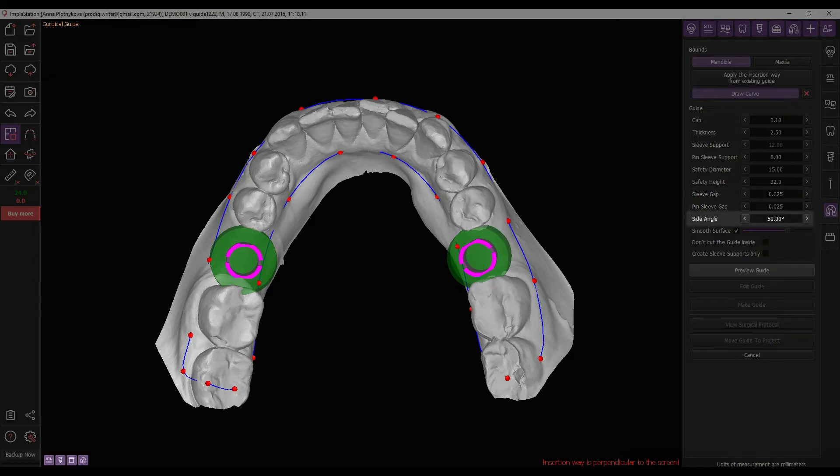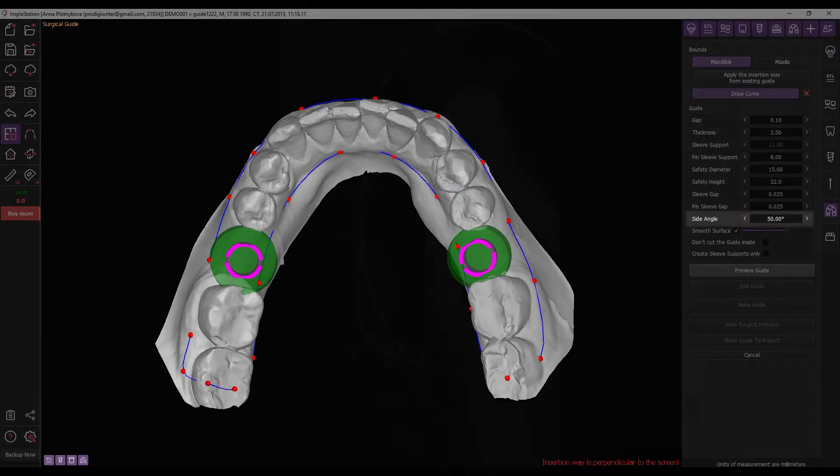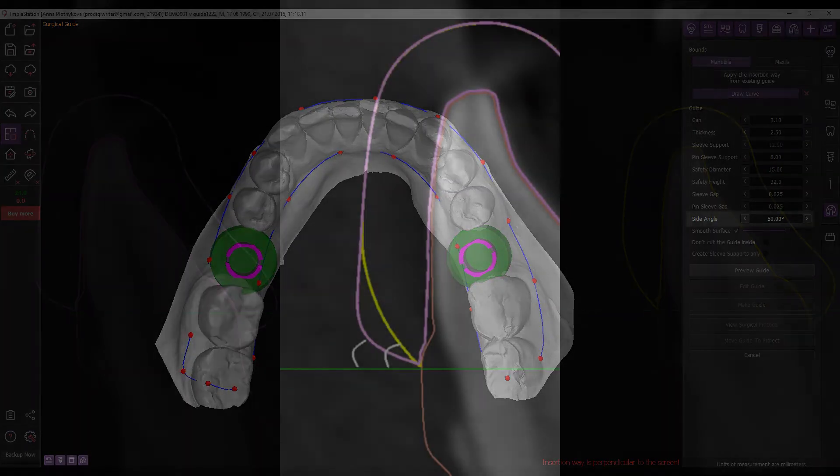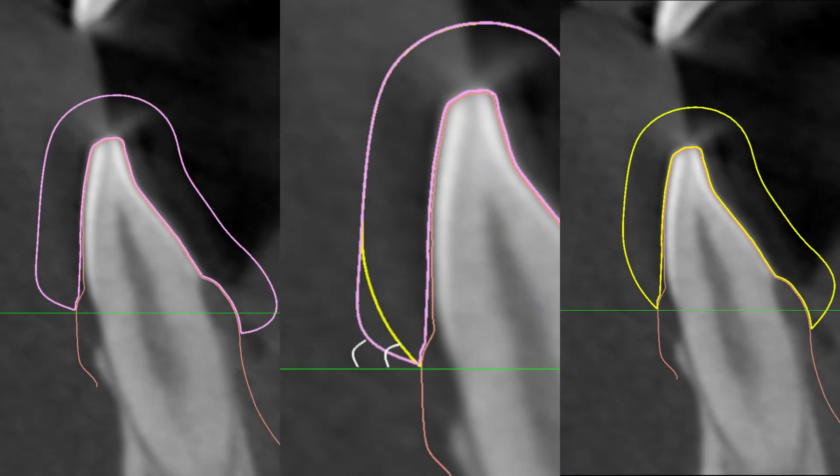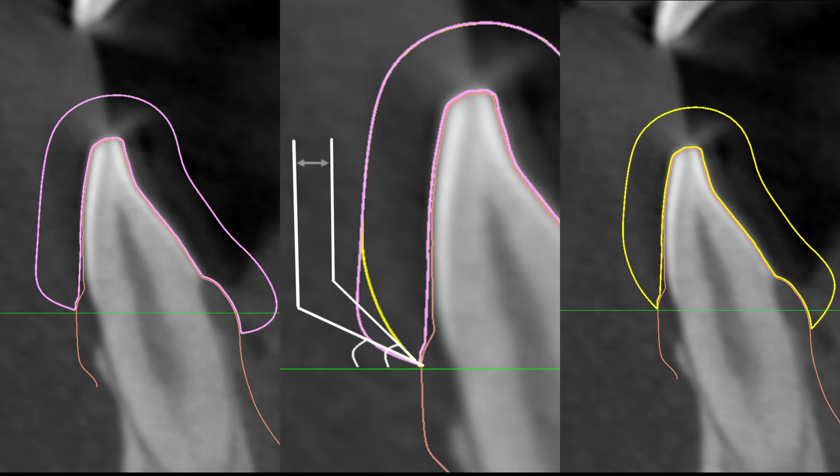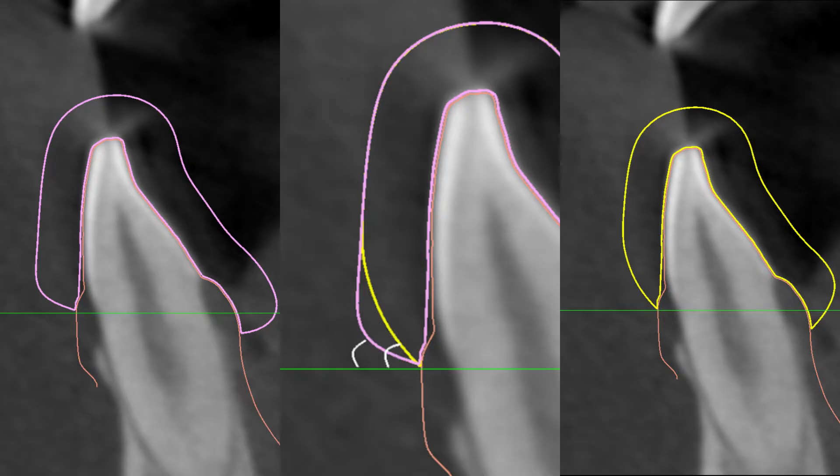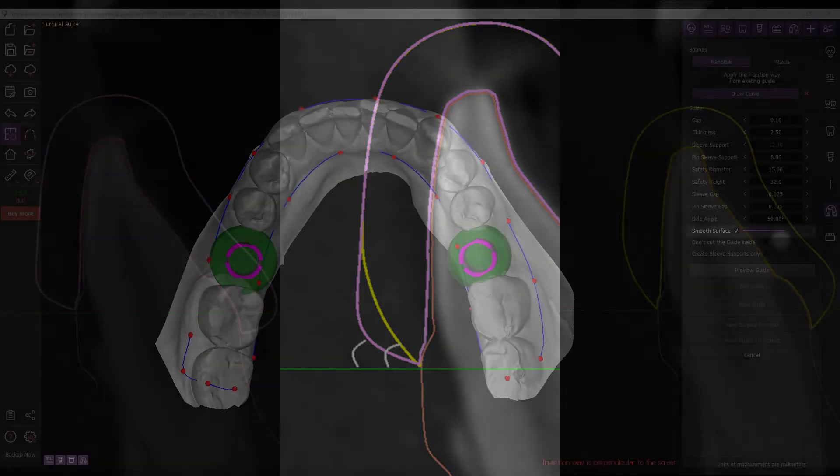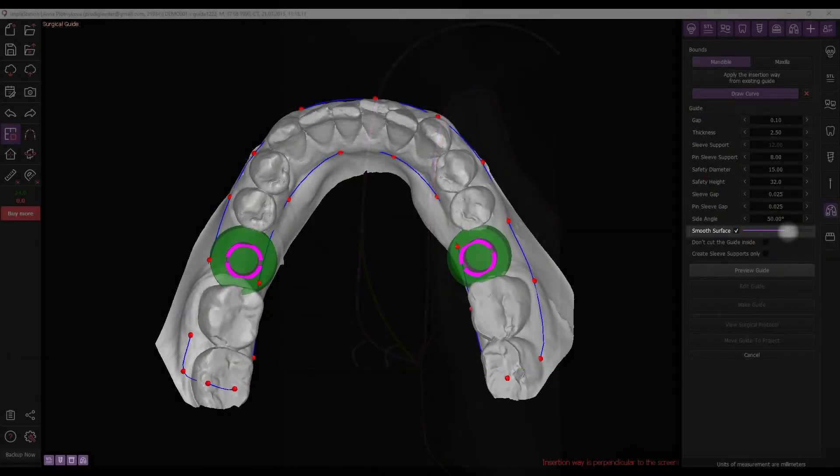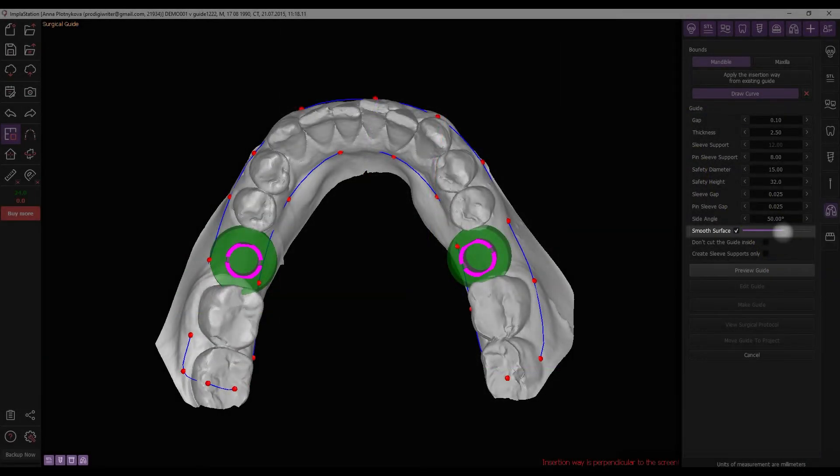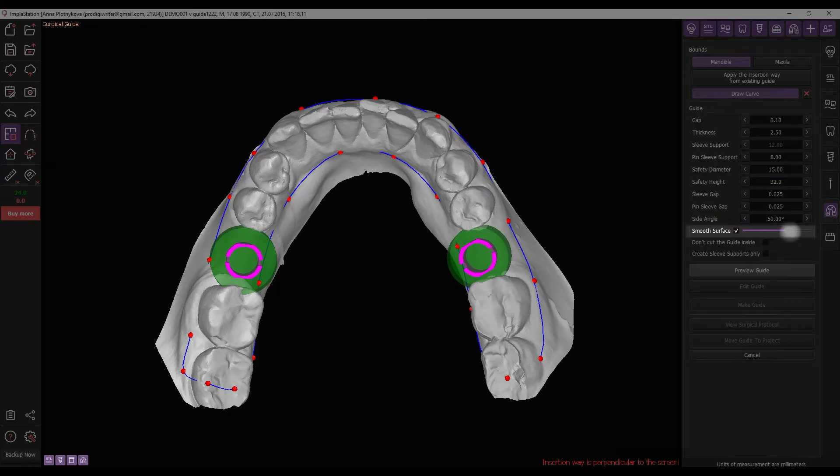Set the side angle. This parameter in guide generation determines the angle at which the vertical wall is cut, crucial for adapting to individual anatomical characteristics and insertion paths. Modifying it directly impacts accuracy and efficiency by minimizing excessive removal and ensuring a precise fit. Also, activate the smooth checkbox and adjust the desired level of smoothing using the slider.